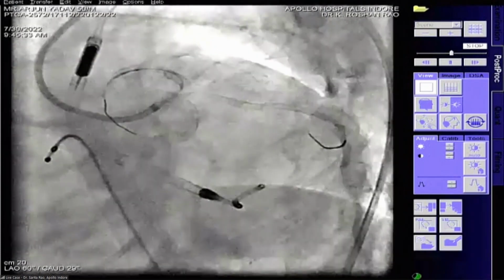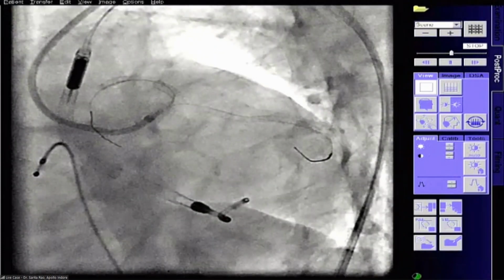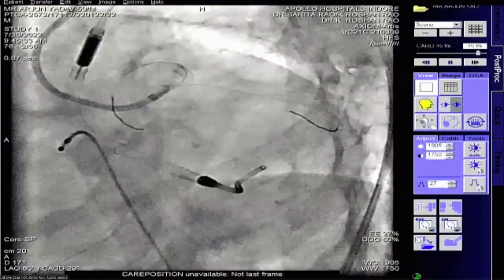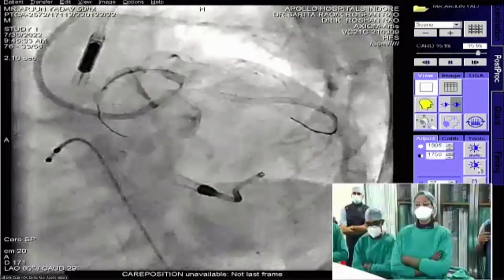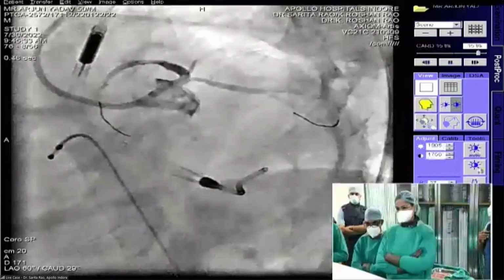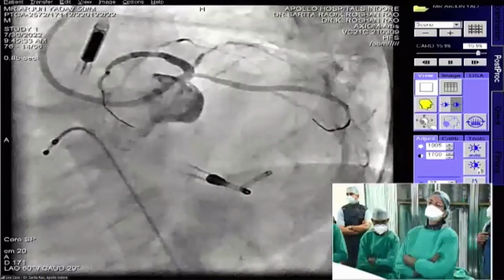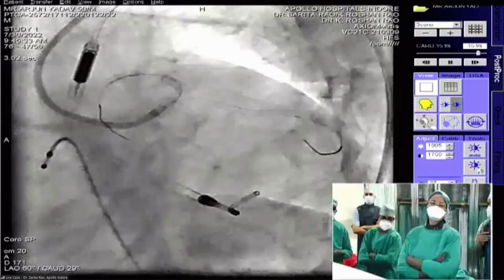That looks better compared to the previous angiogram. Great demonstration, madam. Congratulations. I think you'll also check finally an OCT run also. And words of applause you can hear from all of us. Great demonstration of an Impella-supported severely dysfunctional post-infarct patient, with all care.